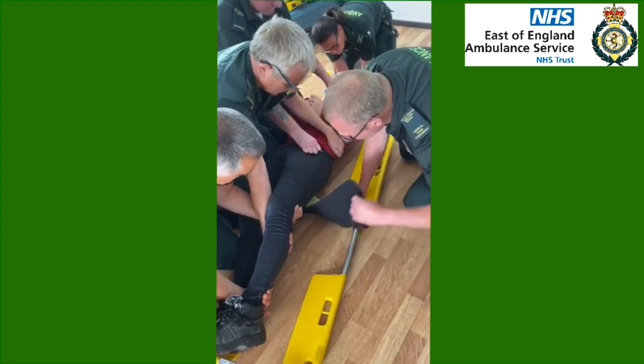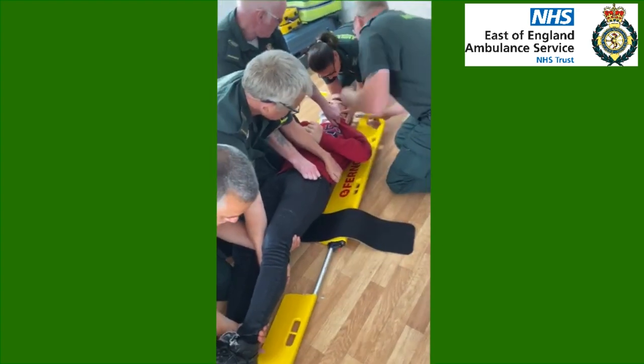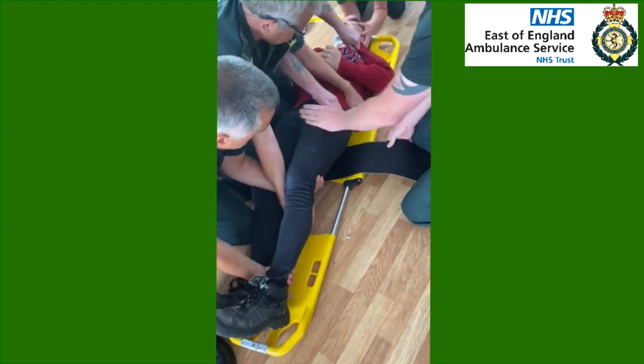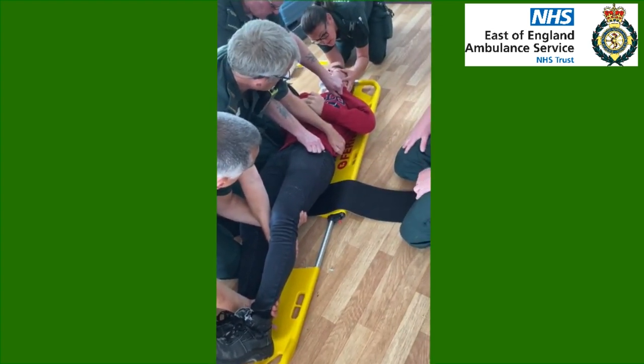Okay, I'm going to take the pelvic binder out from this side first, and then I'm going to click the scoop in at the top first, followed by clicking the scoop in at the bottom. Okay, in position we are. So we'll go back on your command please Sarah. Ready, set, roll.